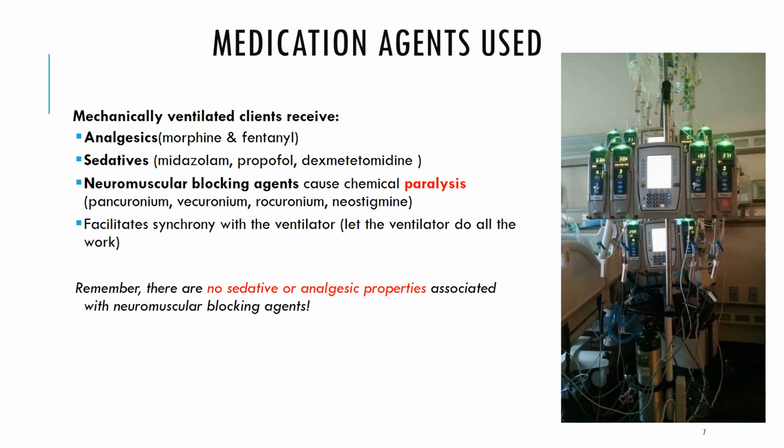Well, sometimes a patient is so sick, for instance, let's say they have ARDS, that we do not want them to do any breathing on their own. We want the ventilator to do all of the work. And even sedating them is not enough to prevent them from breathing on their own or fighting the ventilator. So we're watching their oxygenation drop, we're watching them become hypoxic. We can't sedate them anymore, but they're not letting the ventilator work. Maybe we're seeing these high pressure alarms. So in those severe cases, we may choose to paralyze the patient.